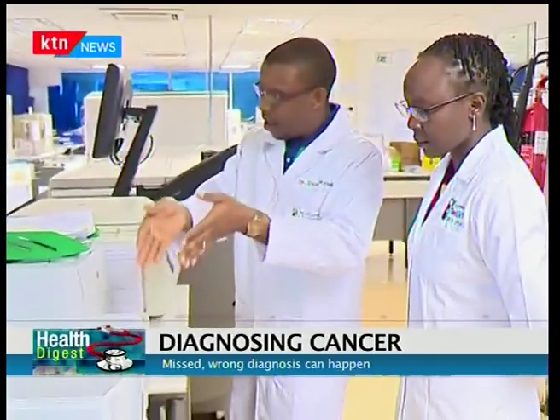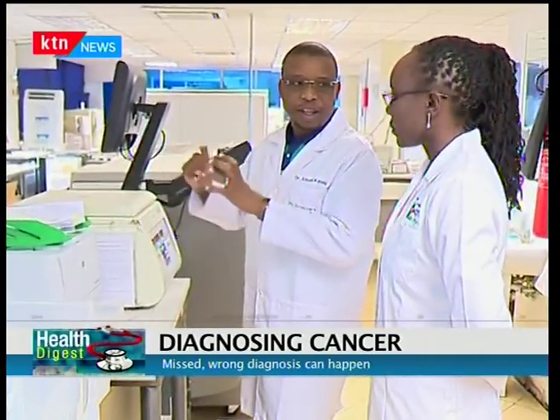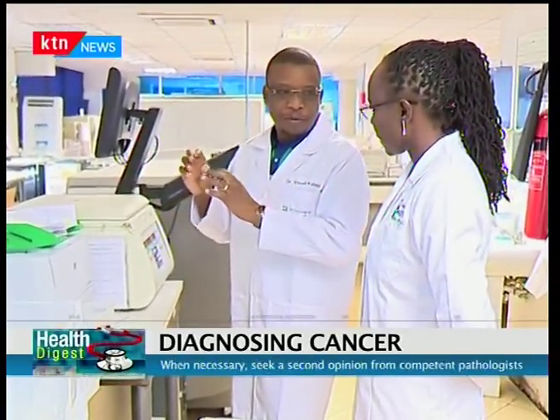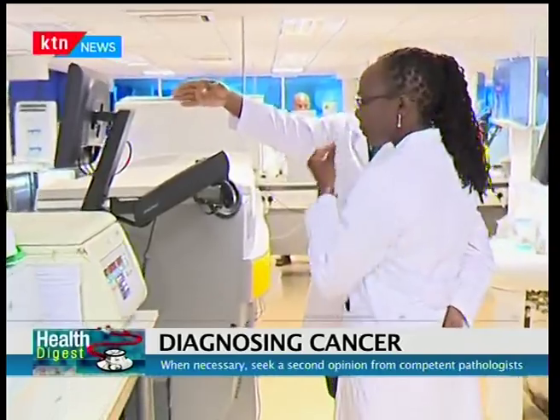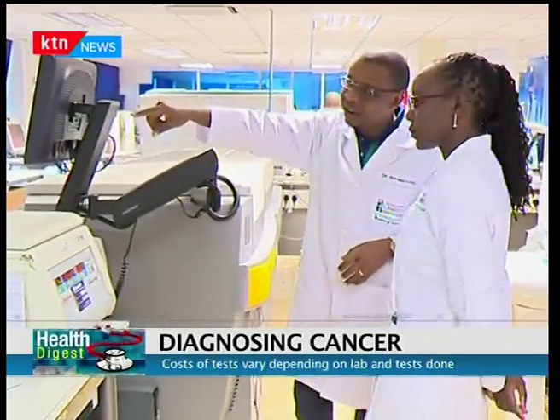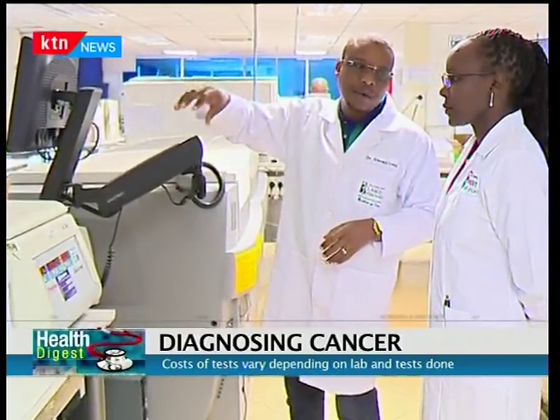For prostate specific antigen, you can see it there. This is then put in the centrifuge. Here it is. They separate the serum from the cells. Then the serum is what is used in the laboratory. So these are all machines that are dedicated for specific analysis. Like this one does beta HCG, which can be used as a cancer marker for a certain cancer called choriocarcinoma.